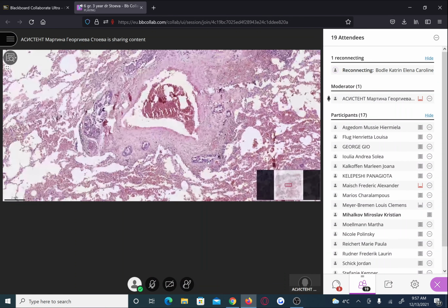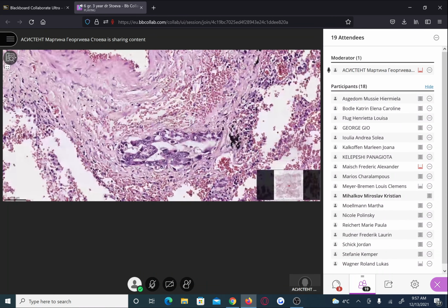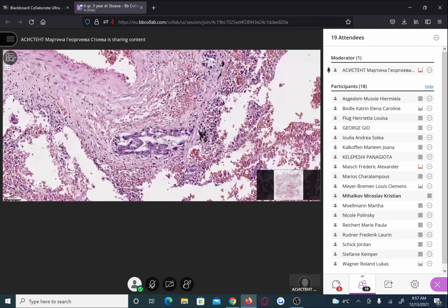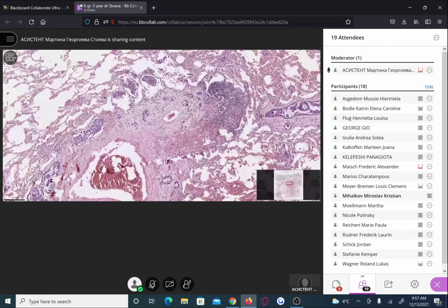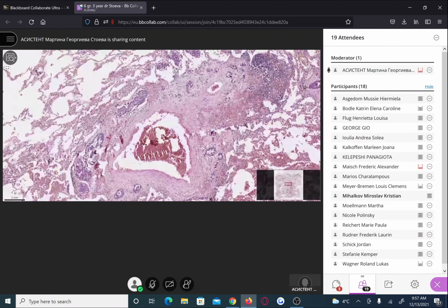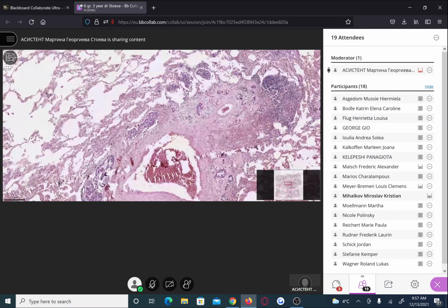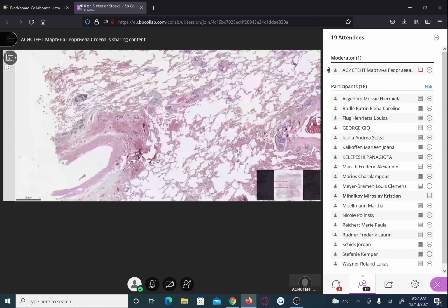When a tumor forms glands, you know that it means that this is adenocarcinoma. So here we can discuss that these tumor emboli come from a primary tumor, which is adenocarcinoma. It could be from the colon, from the stomach, it could be even from the lungs. Here again, you can find them.